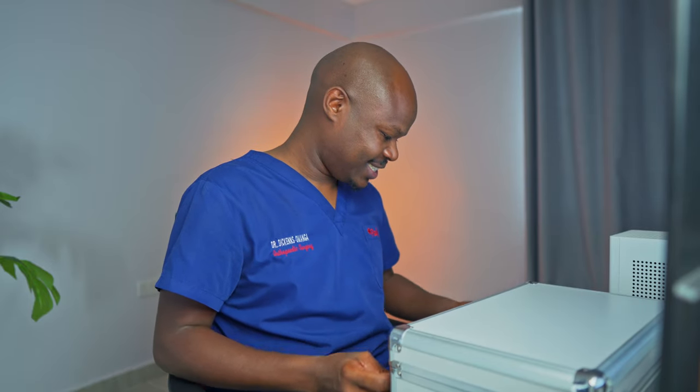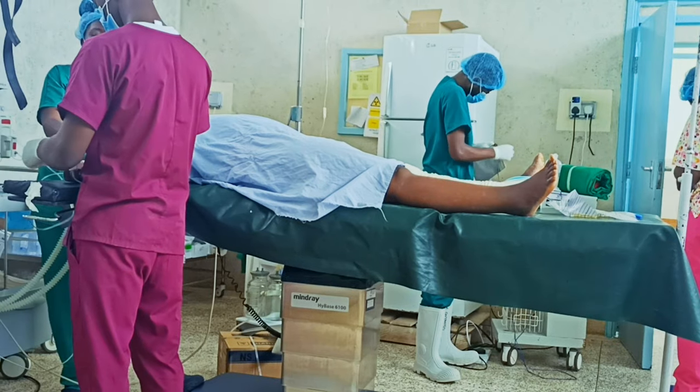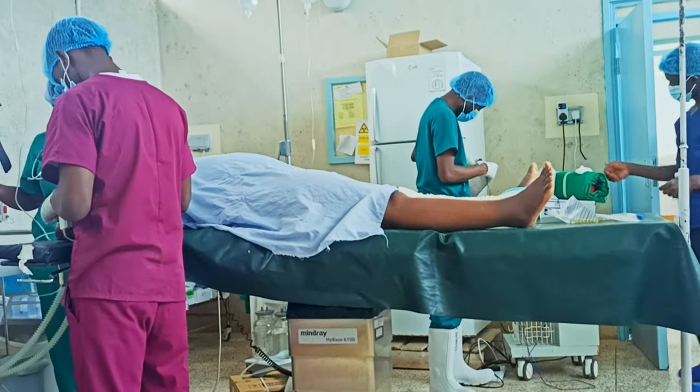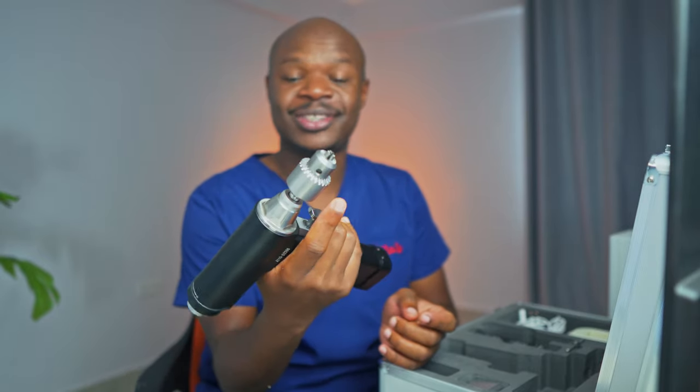I'm going to show you how we get those screws inside your bones. This here is actually a drill. Interesting, right? Orthopedic surgery has actually been compared to carpentry or some sort of woodwork by a lot of guys, because we use a lot of tools that are actually used in woodworking, metalwork, and so on. And one of them is this — this is actually a drill that we use in theater.